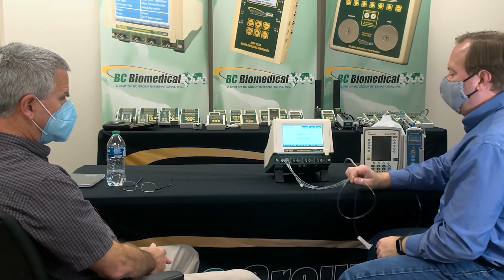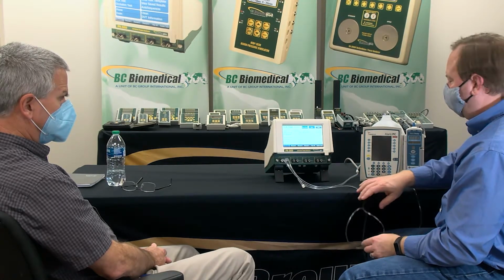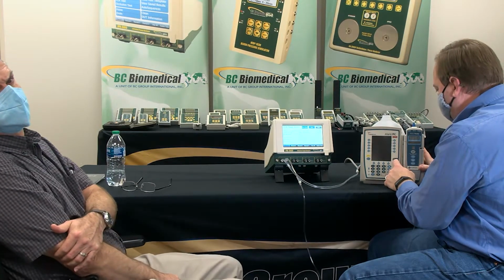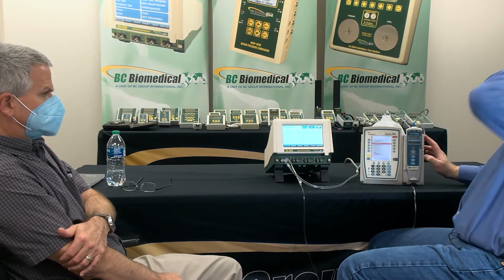But since we're testing the pump, wouldn't a PCA also be checking, if it says the limit is the patient can only hit that button 5 times in an hour? Yeah, and that's what that bolus interval setting is. So you can set it for 6 minutes, 10 minutes, whatever. That's how fast it can get those boluses. And if it's any faster than that, then it fails the test.